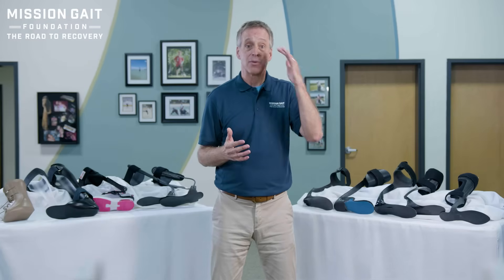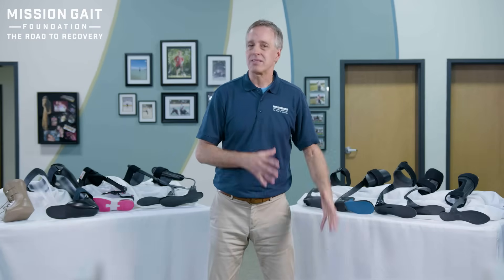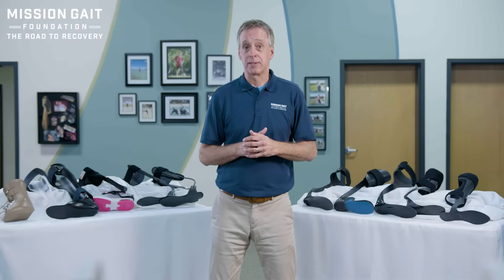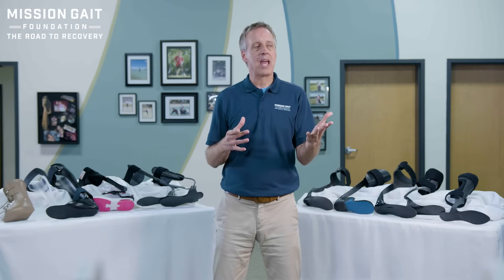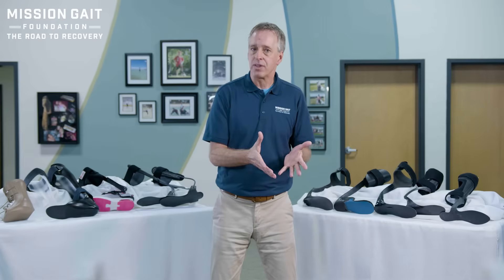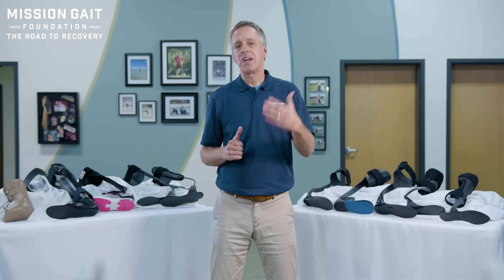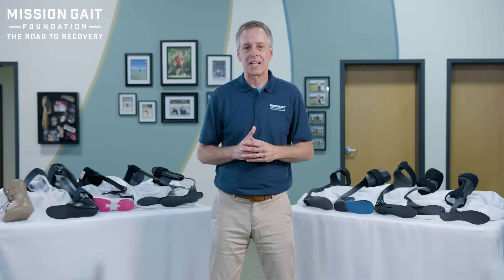You also need to consider patient preference — what are they willing to wear? Something with lots of straps and complexity that they simply aren't going to be willing or capable of working with is not the right choice. Let's review AFOs and look at both custom and non-custom devices. A custom device is made specifically for you and will be the best possible fit, but off-the-shelf braces are much, much better than they once were, and there are very good off-the-shelf options for patients.